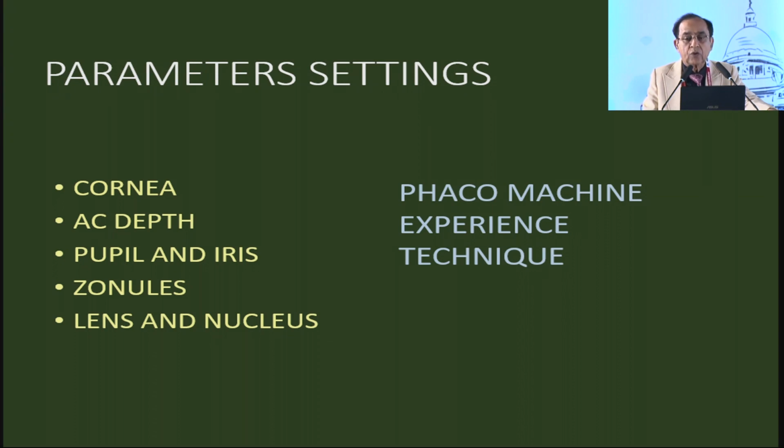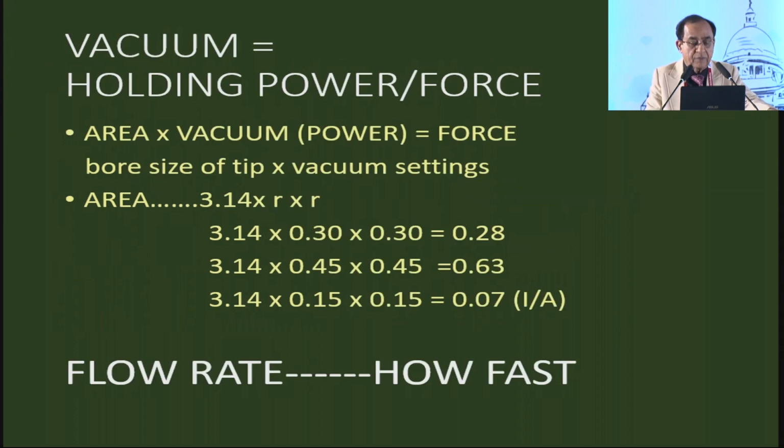The setting will also depend upon the type of machine you have, whether it is a third generation or fourth generation machine, what experience you have, what technique you are going to adopt, and which step of the surgery you are at.